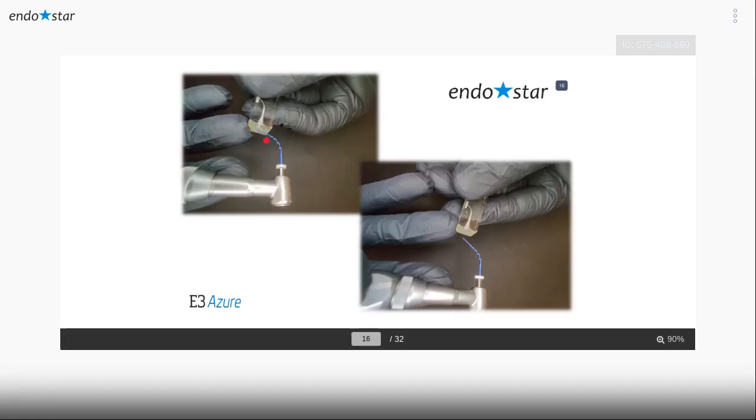I curved the file on the block, and when I remove the force, it keeps the shape. So this point has a lot of applications in our practice. Some people say, no, I use it only to pre-curve the file. No, we will speak about it today. You will get a lot of benefits. I now use it in maybe 70% of my cases without any kind of manual files.